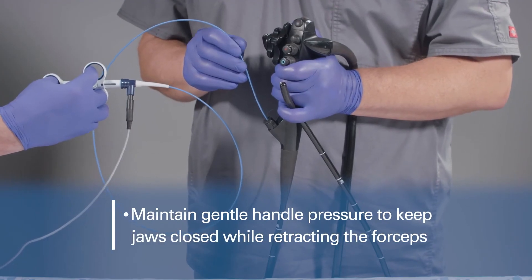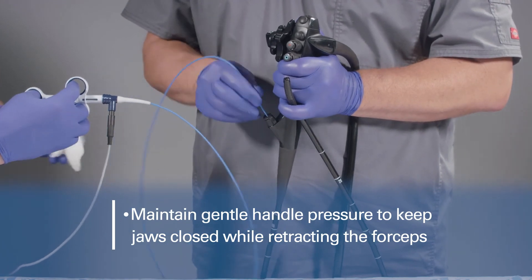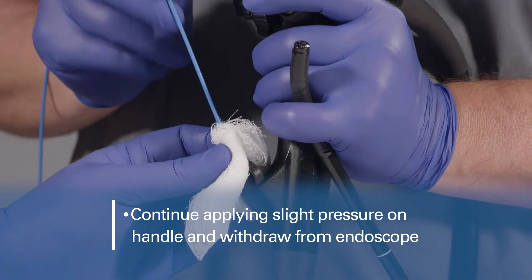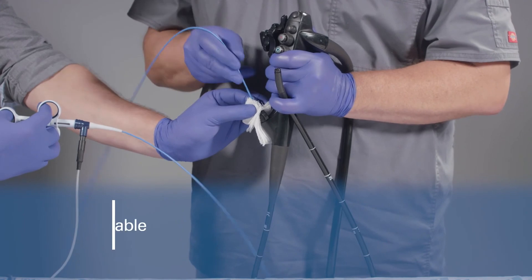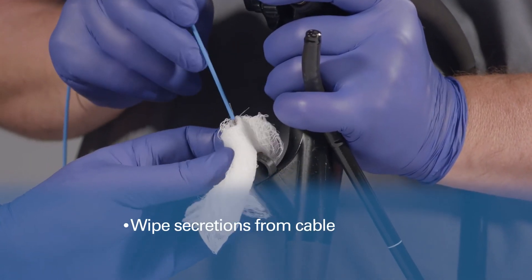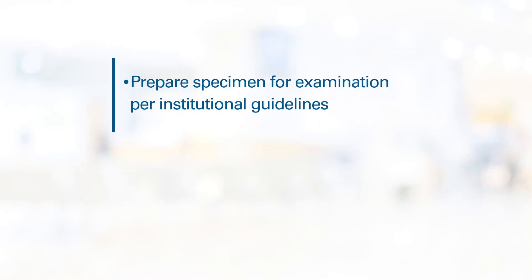Maintain gentle handle pressure to keep the jaws closed while you retract the forceps from the site. Continue to apply slight pressure on the handle and withdraw the forceps from the channel. While withdrawing the forceps from the endoscope, wipe excess secretions from the cable. Prepare specimen for examination per institutional guidelines.